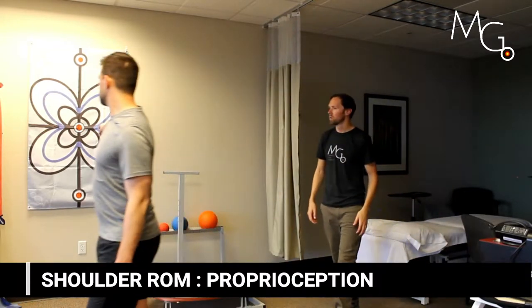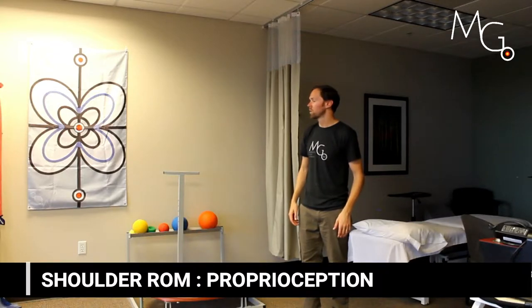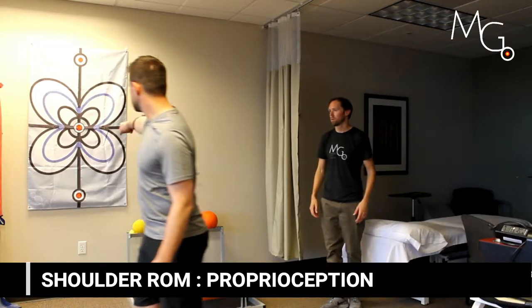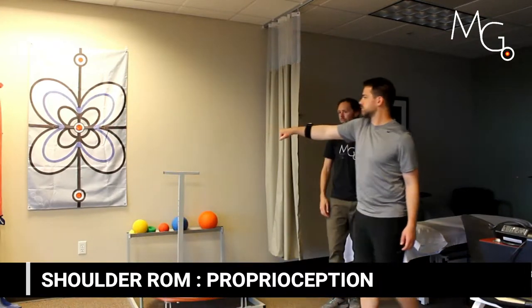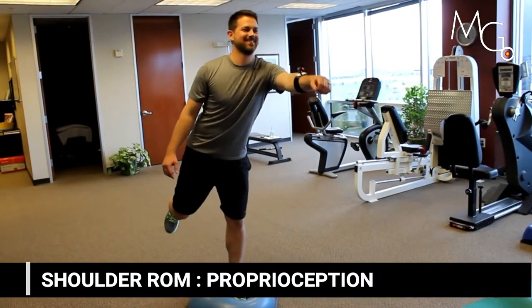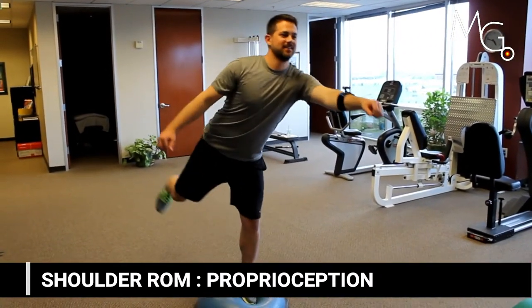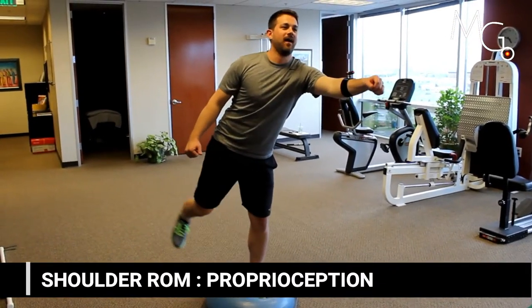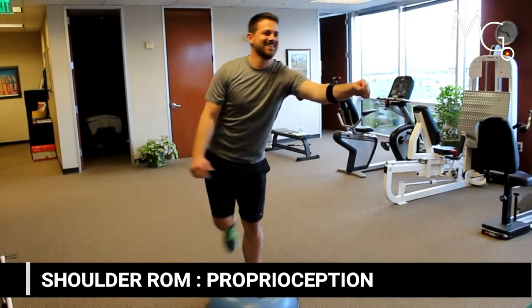This would be an example of a static function of the system, where you're trying to keep the laser in the center of the target as opposed to moving during an exercise. More dynamic functions might include standing on a BOSU ball and adding motor control skills to that exercise, such as tracing butterfly shapes on the target.